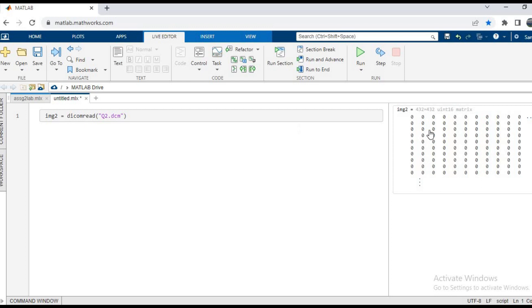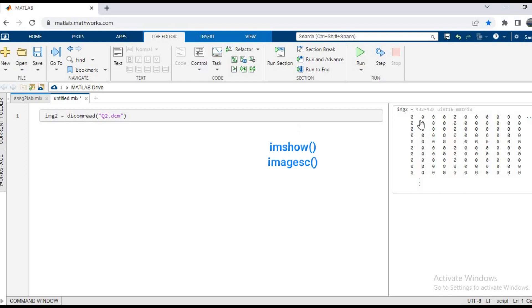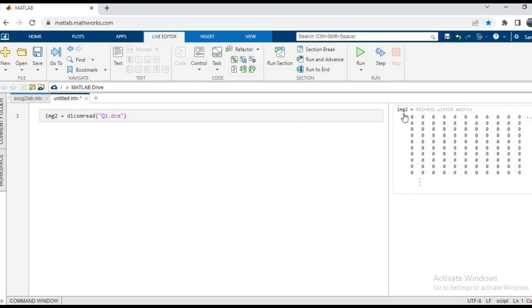So let us try. We have two functions again: one is imshow and the other is imagesc. First, try the imshow function. We'll write imshow bracket image2, then run it.